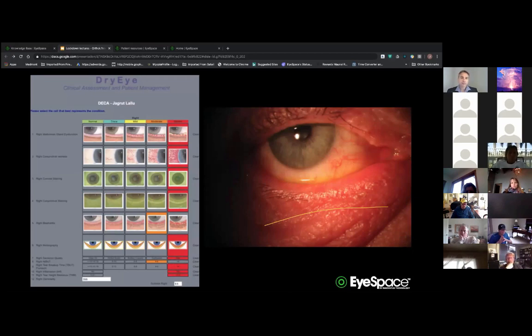Well, one question that comes up a lot on many of the forums, whether it's on Facebook or on these email forums that we're on, usually from a new practitioner, is: is a patient with dry eye contraindicated for orthokeratology? Well, our view is that as long as you manage and treat the dry eye appropriately and understand its cause, then there's no reason why you can't treat these patients with orthokeratology.